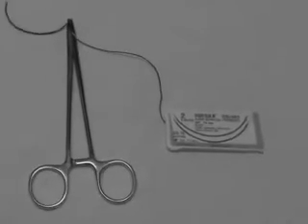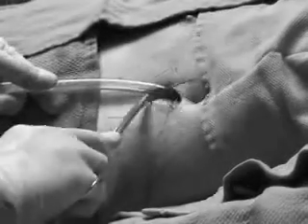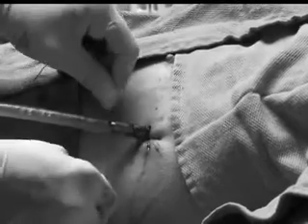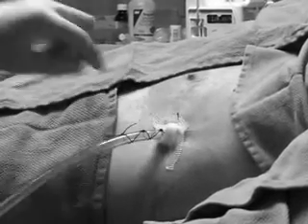Secure the chest tube to the skin using the heavy sutures. Simple interrupted or mattress sutures are often satisfactory to ensure stability of the tube and avoidance of air leaks around the tube. The free ends of the sutures are wrapped around the tube and tied multiple times to secure it in place. Purse string sutures are not recommended as they yield poor cosmetic results and increase the risk of skin necrosis. Once the chest tube has been secured, a petroleum-based gauze dressing should be wrapped around it. Apply several pieces of sterile gauze around the tube. Secure the site with multiple pressure dressings.